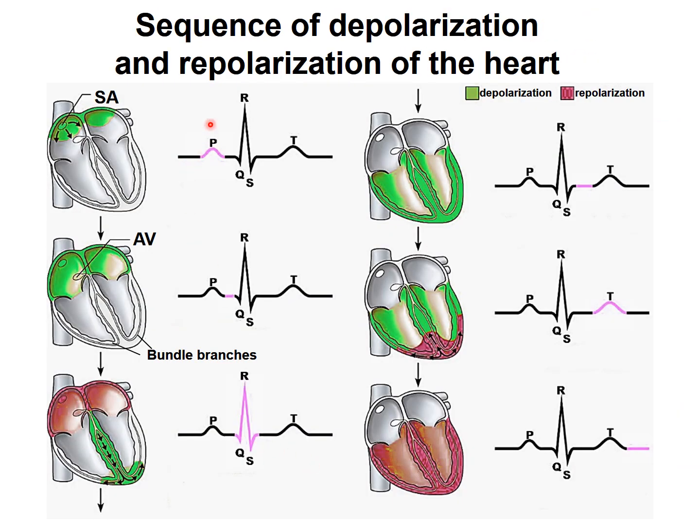When we are looking at the ECG tracings and what is happening in the heart, we can see that the atrial depolarization is represented as a P wave on the ECG tracing. We do not have any sign of the sinus activity. Only the atrial depolarization can be seen on ECG. Next, when the discharge goes through the AV junction, we see nothing. That's the isoelectric line, and that's the distance between the P and the QRS complex.